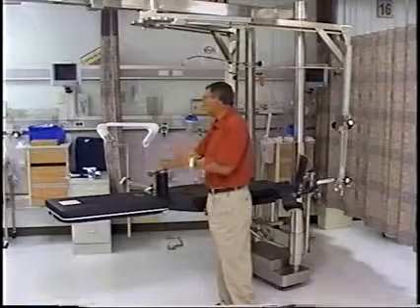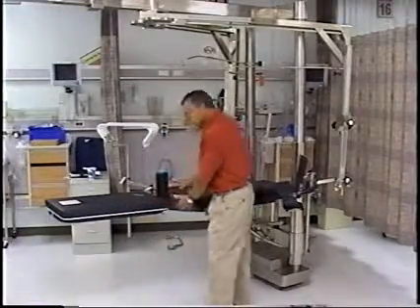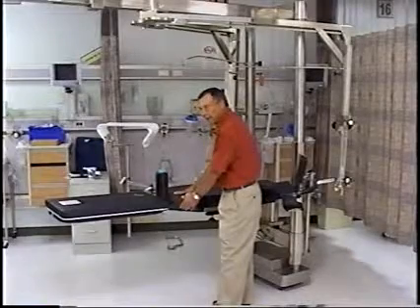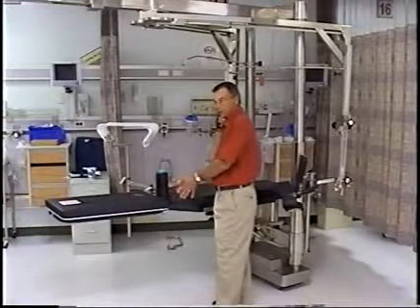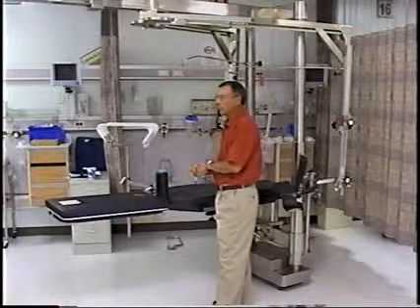I don't think anybody's ever asked us to use it. Yeah. It depends on the doc. You can get good images through here without that. But sometimes the doc can't get good access depending on the severity of the compression he's doing.